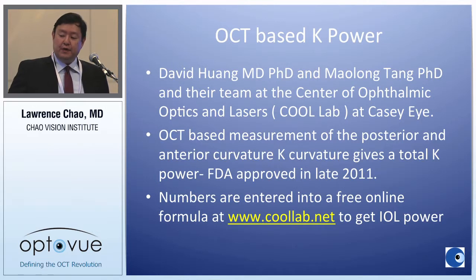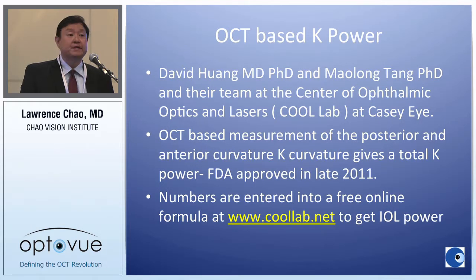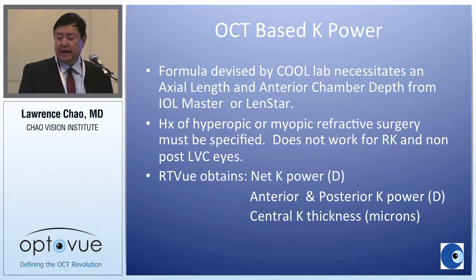So we owe a lot of this credit to David Huang, who's one of the inventors of OCT, and his research team at OHSU up in Oregon. He started a lab called the COOL Lab, which stands for the Center for Ophthalmic Optics and Lasers. And they pioneered this work to measure both the anterior and posterior corneal curvatures to give a total corneal power. And I think this was approved somewhere around November of 2011. These numbers are then entered onto a free online formula at coollab.net to obtain an IOL power.